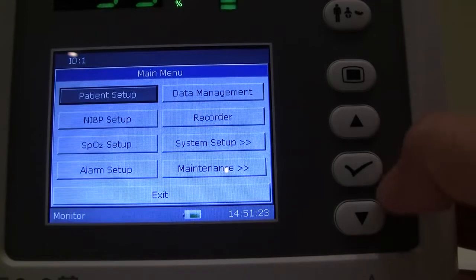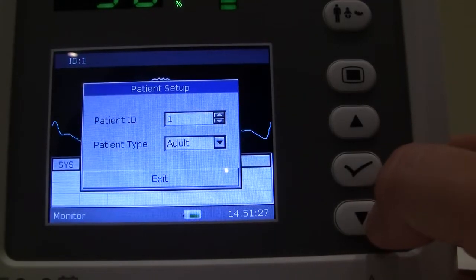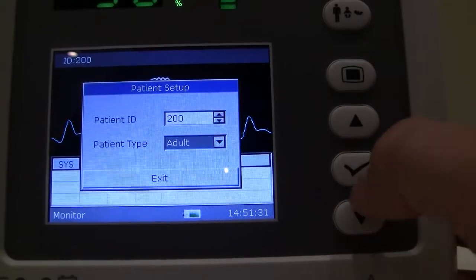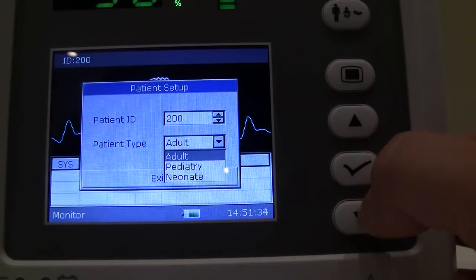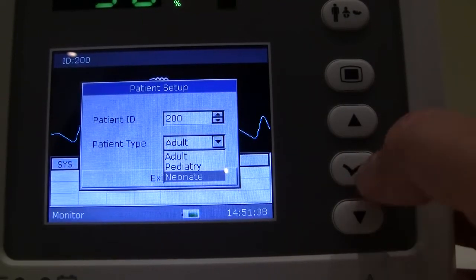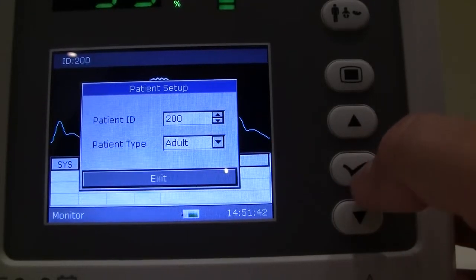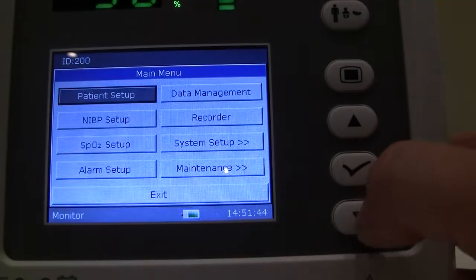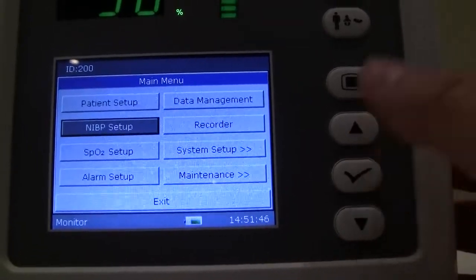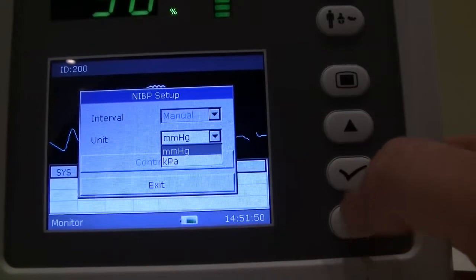For administering a new patient, you want to go to patient setup. You can associate a patient ID number here anywhere from 1 to 200. And again, you can also from this section select if it's an adult, pediatric, or a neonatal application. Or like I'd mentioned, you can use the shortcut key as well on the front of the monitor. NIBP setup is where you want to change your setups here.